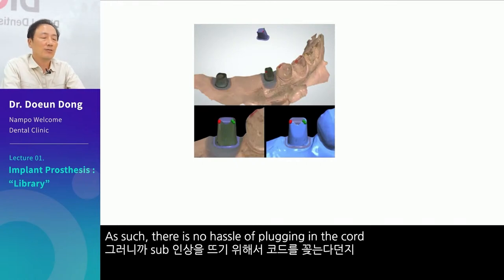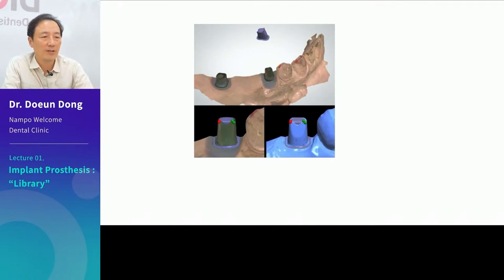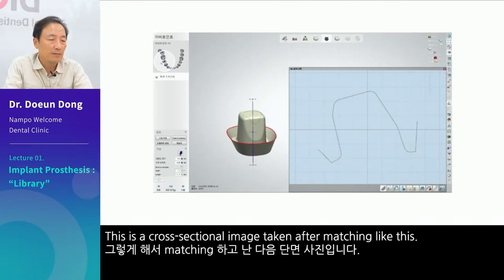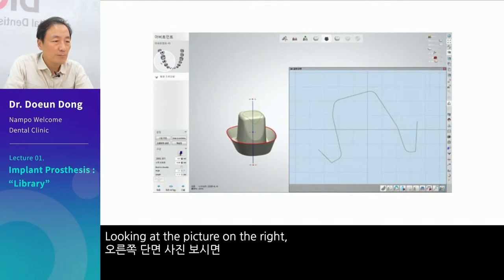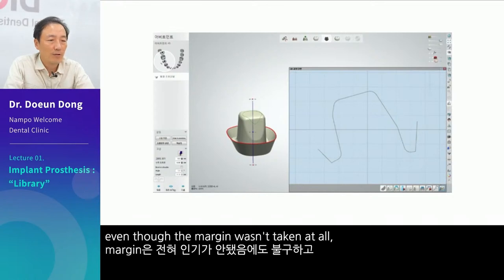As such, there is no hassle of plugging in cord to take a sub impression or having to control bleeding. This is a cross-sectional image taken after matching — looking at the picture on the right, even though the margin wasn't taken at all, it was automatically matched.